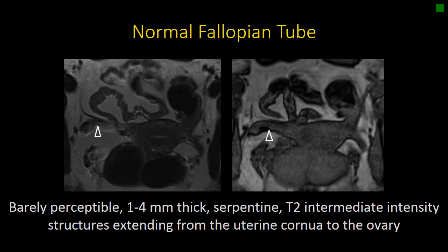On MRI, the fallopian tube itself is often barely perceptible. It's described as being 1 to 4 millimeters in thickness when normal, and having T2 intermediate signal, which is why it's difficult to distinguish from adjacent structures. Sometimes an opposed-phase image can create an India ink artifact, separating the fallopian tube and mesovarium from the adjacent fat, making it more readily apparent.